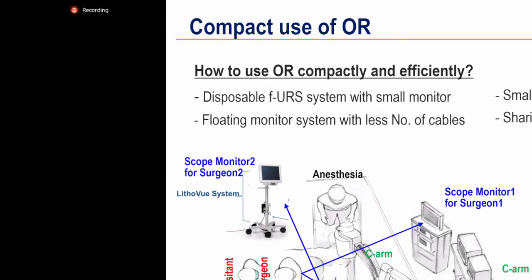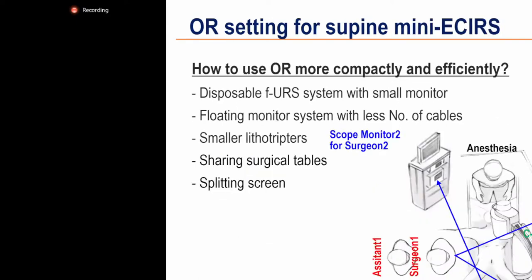And actually, I have to agree with this opinion as a disadvantage of the combined approach. If the surgery is focused on the main surgeon, basically we cannot deny the problem of the large number of devices for a combined approach. But if the main procedure is focused on the main surgeon and the assistant can help and facilitate the main surgeon's surgery, then we can increase the efficiency of surgery as well.